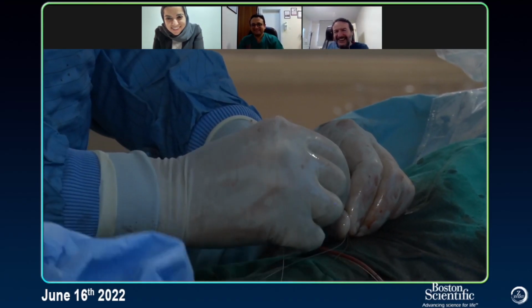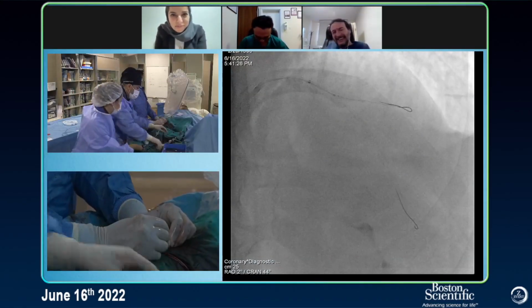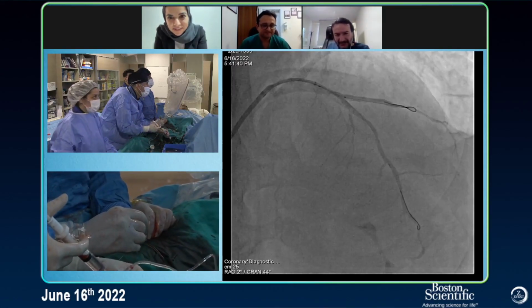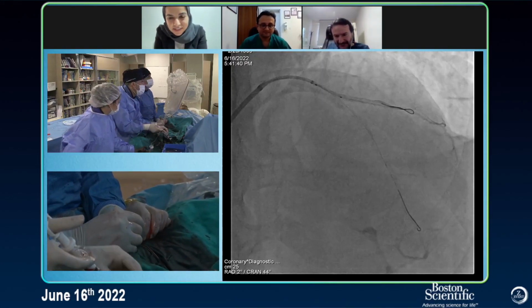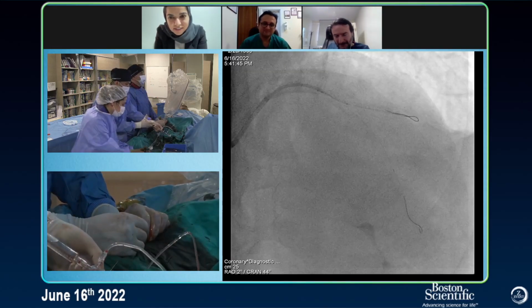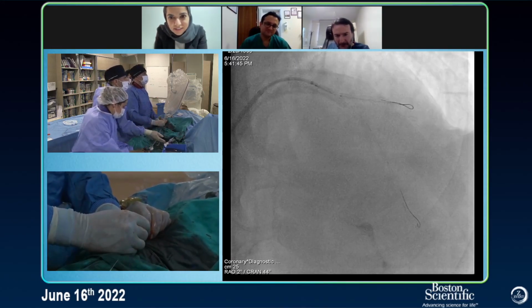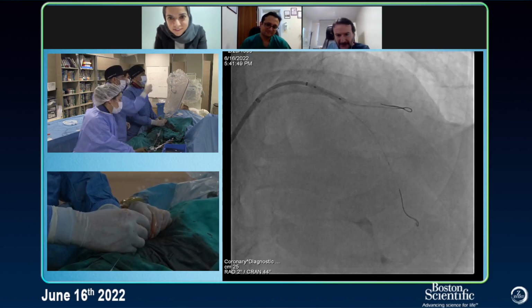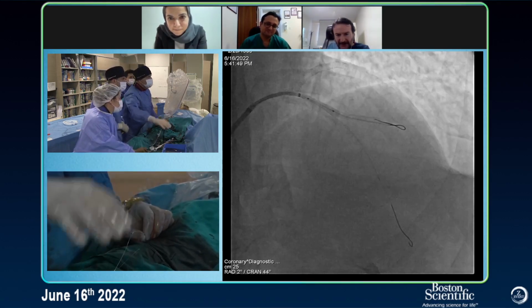Test, please. All right. Yes, good. Okay. Go up. Go, 10, go. 14. 20. But good opening. That's not bad. Opening is okay. Down.